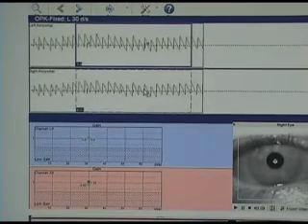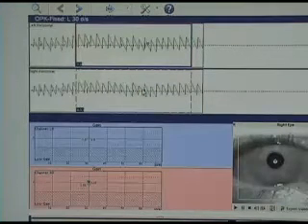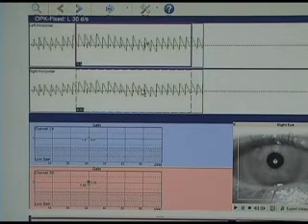So this is what a normal OPK or optokinetic graphing would look like, and basically when the stimulus goes by, whether it's bars or little balls that go across the screen, what a patient's eyes will do is they will slowly track them and then they fast refixate. So these sort of bent lines here are the slow tracking, and then the ones that are sort of upright, which is to the right, this is a stimulus to the left, which is a left brain.